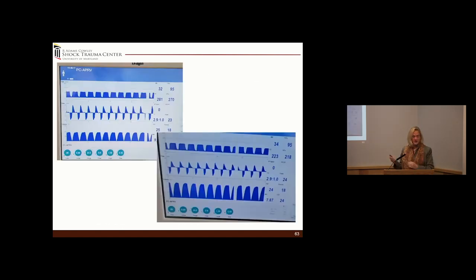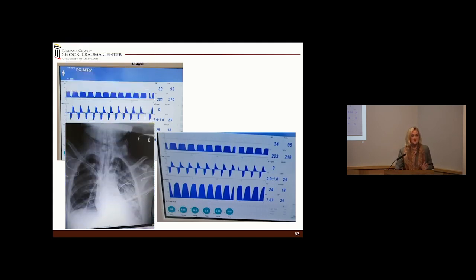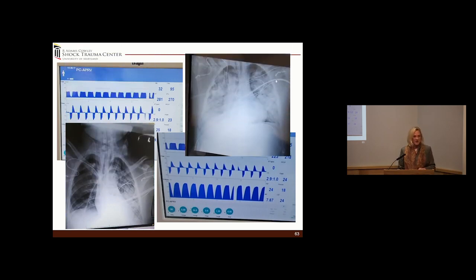And you'll see this. This is actually an example. Funny how that happened. So here is a T-low of 0.45, and you can see the angle here, and this is 75%. And now this patient, here is the chest x-ray. It's still ugly, trust me, that's not good, but it got uglier. And this happened when the patient was disconnected, and the tubing was disconnected inadvertently.